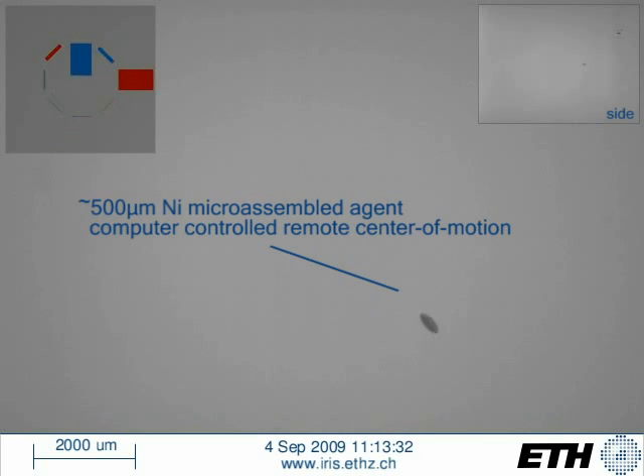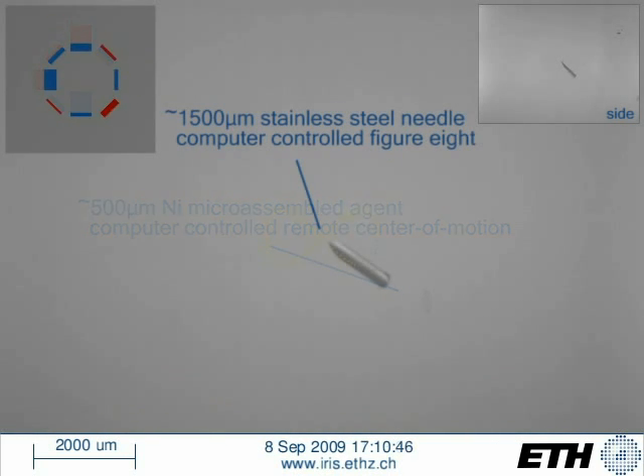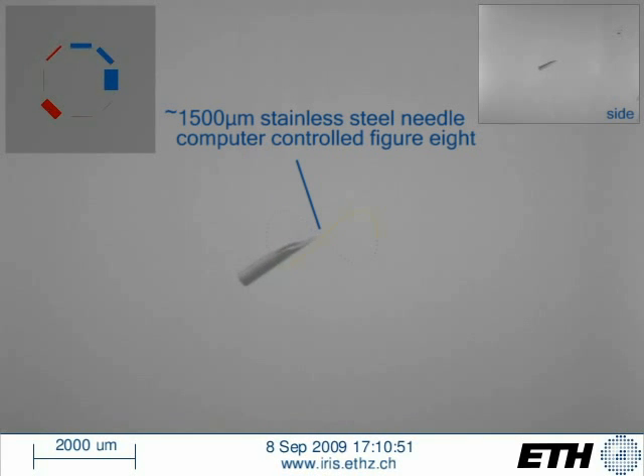When using the camera feedback for closed-loop control, the device is able to precisely and repeatably follow pre-programmed trajectories as well as respond to user input.